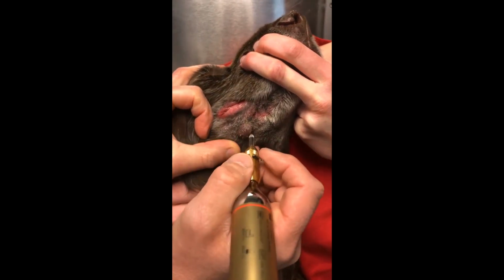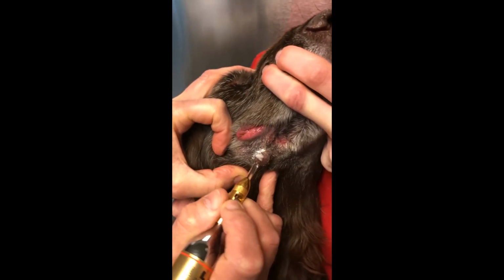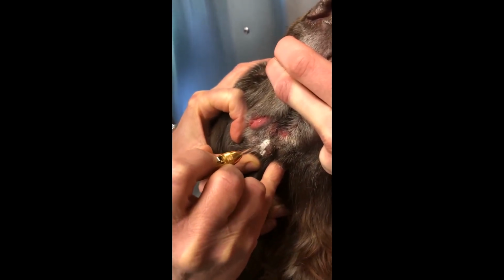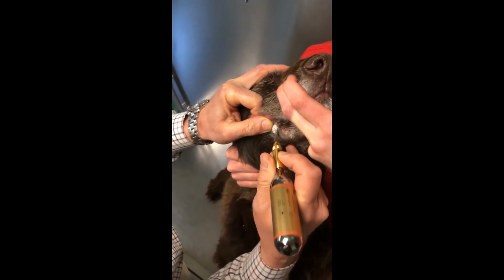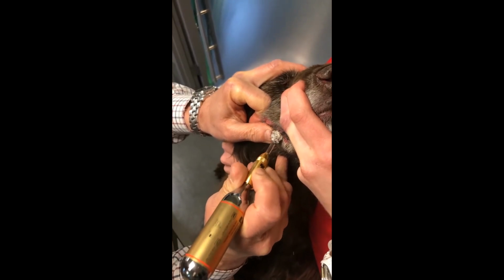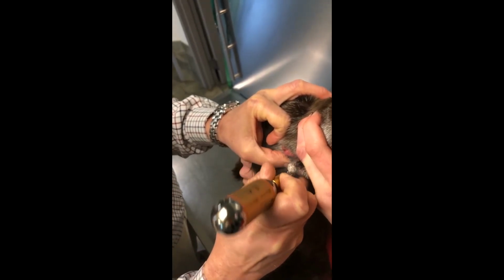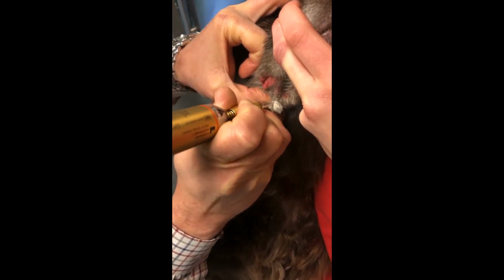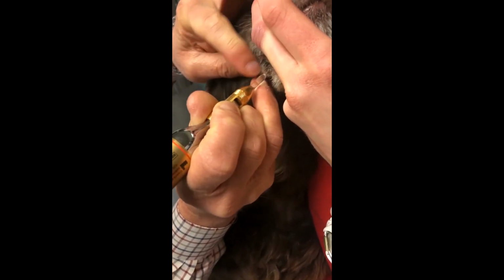Given the large size of this mass, we're going to use the D3 tip. And again, we're going to freeze the entire mass. We're going to work on approximately 50% of the mass at a time because of the size of this mass. And then we'll move to the other side. And we're running out of gas. Making sure that we knock off any ice crystals so we get the full thermal effect on the mass.